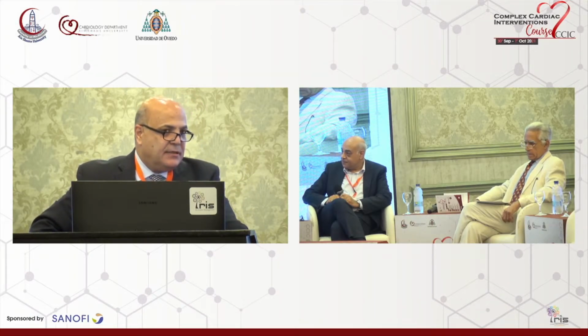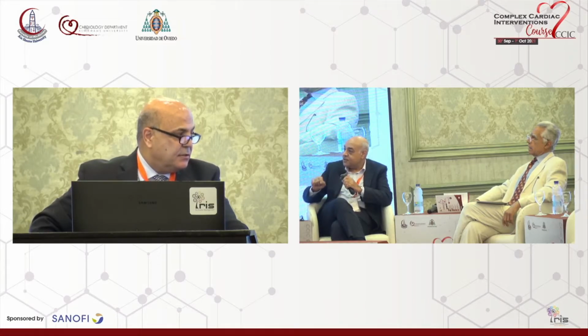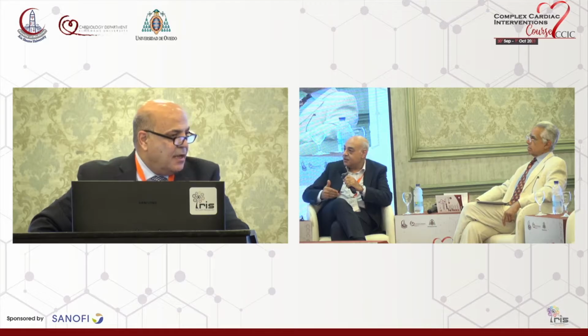And they found that some of these lesions are physiologically insignificant, and you can leave these lesions safely. The prognosis and outcome of leaving a lesion based on the IFR or FFR is excellent, actually. That's why you can depend on this physiologic assessment. And sometimes, in this case particularly, you can leave the ostial circumflex like that, depending on the IFR, and start waiting for the complaint of the patient, or do it in spite of the IFR not being significant.